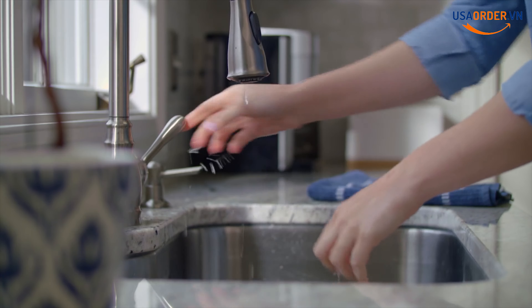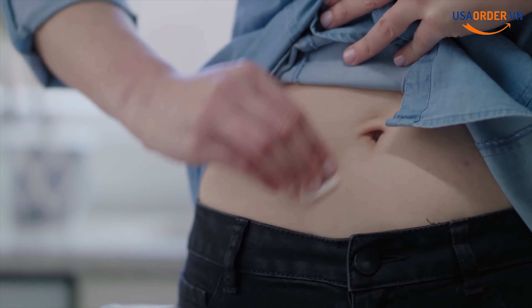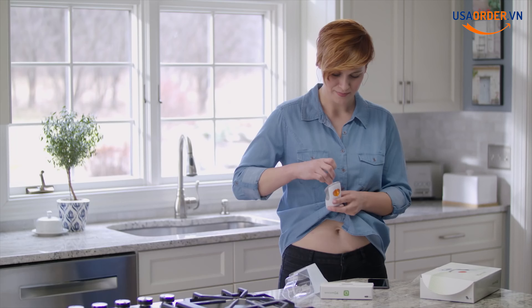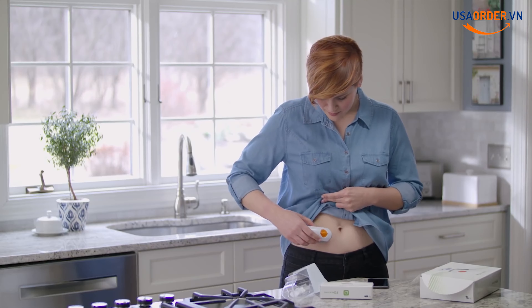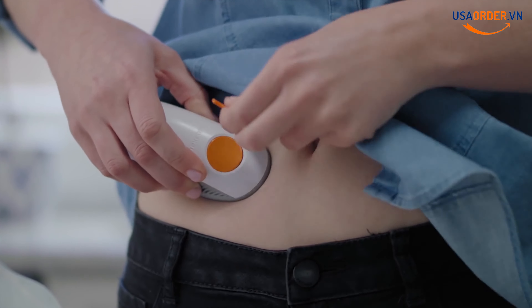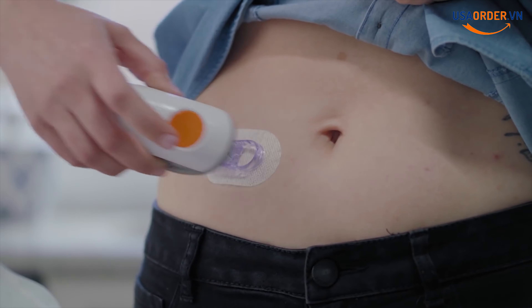First, wash and dry your hands. Clean your skin with rubbing alcohol and let it dry. Grab the sensor you used during setup and remove both labels. Do not touch the adhesive. Place the applicator on skin. Remove the safety guard — fold and break it off. Press the button to insert the sensor. Remove the applicator. You've successfully inserted your sensor.